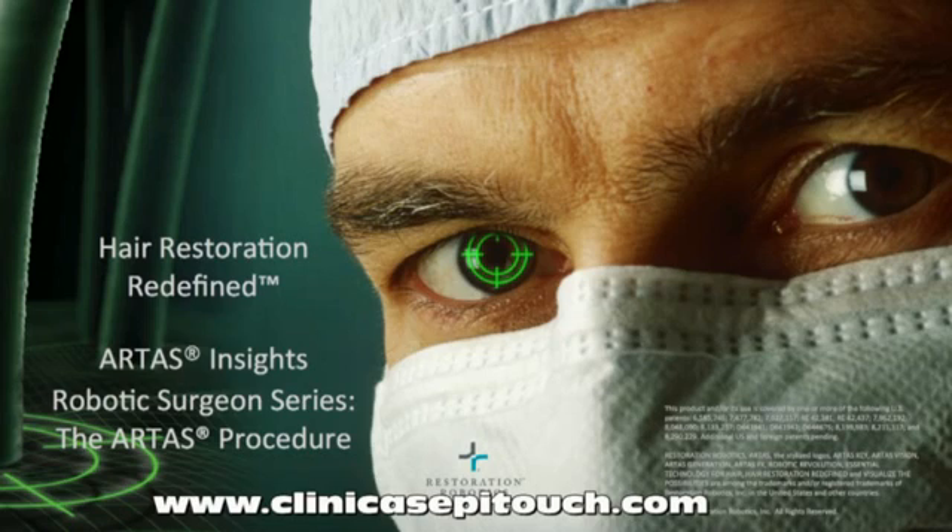Hi, my name is Mike, Technology Manager at Restoration Robotics. In this short 8-minute video, I'll walk you through the various steps of the ARTAS procedure.